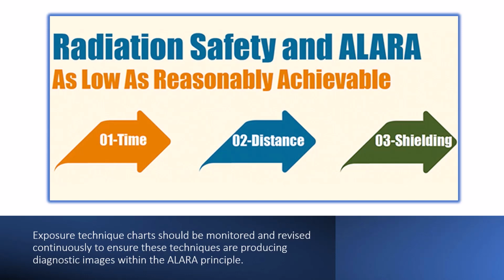Exposure technique charts should be monitored and revised continuously to ensure these techniques are producing diagnostic images within the ALARA principle.